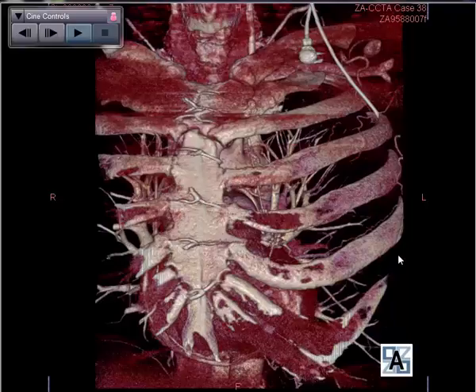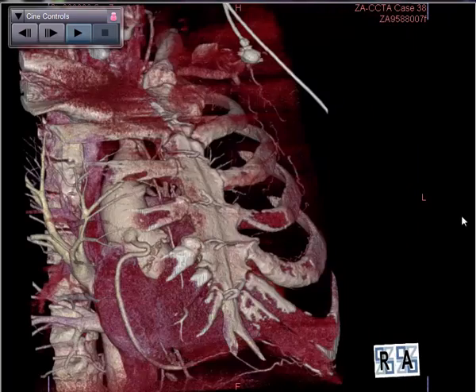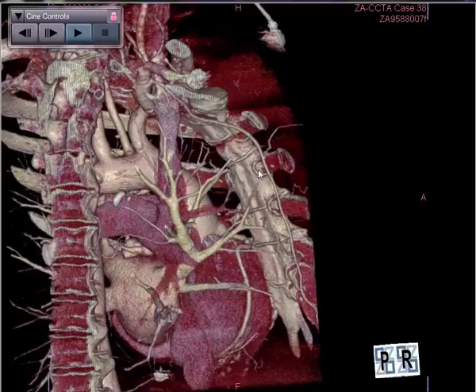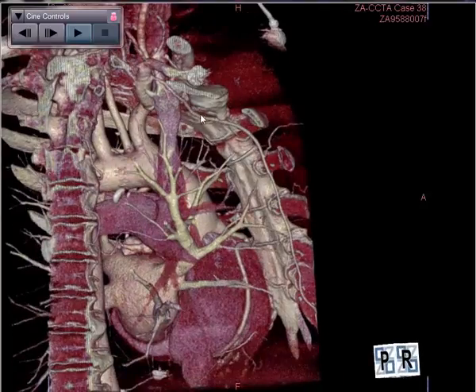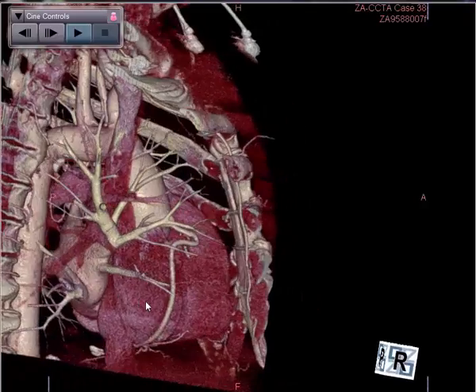Let's start with the three-dimensional images, as are appropriate, especially for looking at bypass grafts. The sternum is quite intact. I'm going to rotate over to a right lateral view. I can get a very nice view of the intact right internal mammary artery. I can see the posterior of the sternum and I can see that there has been a left internal mammary bypass graft performed.